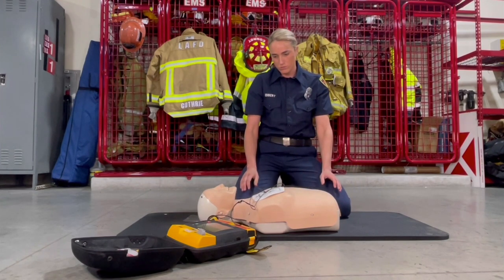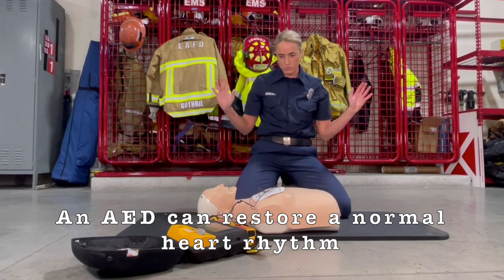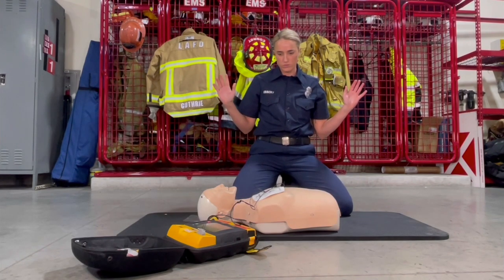The AED will analyze the heart rhythm. Make sure no one is touching the patient. Say clear in a loud voice.